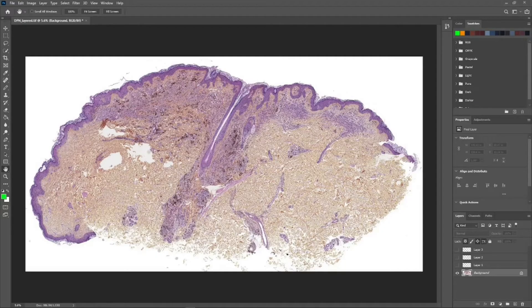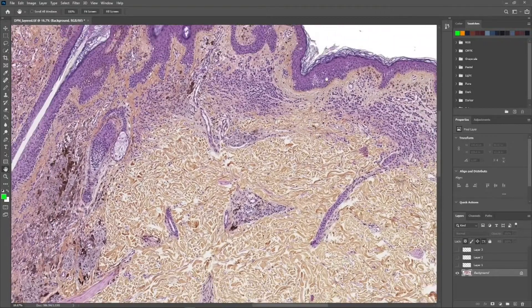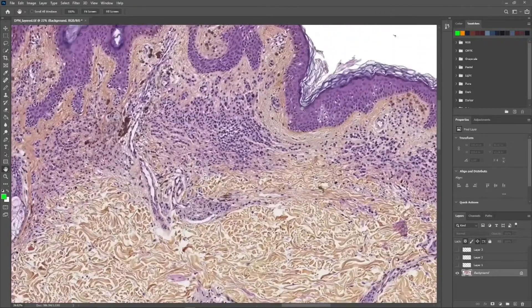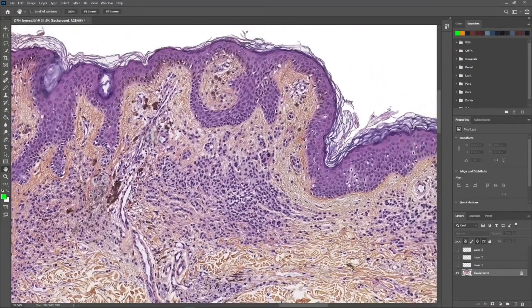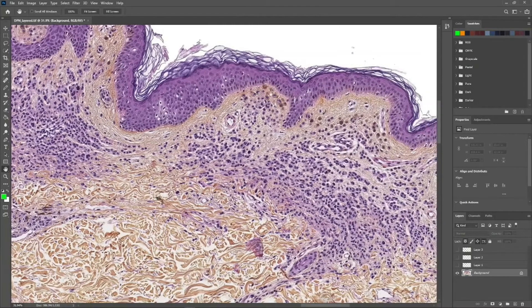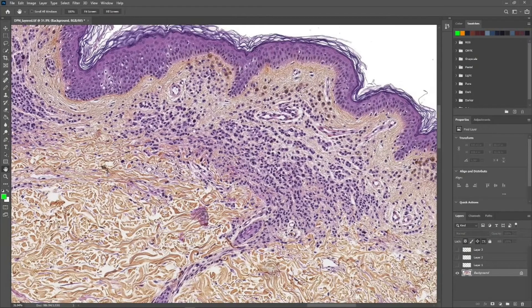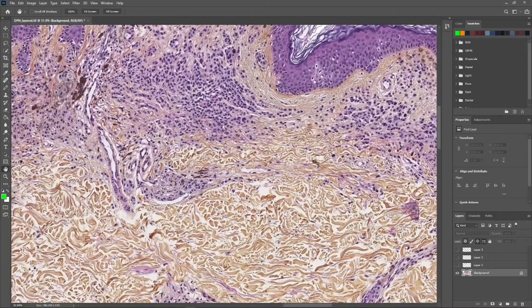If we zoom in on the first area, we have bland melanocytes. There's a slight junctional component of lentiginous small melanocytes, and we have superficial pigmented normal-appearing, really small, bland melanocytes without any atypia.